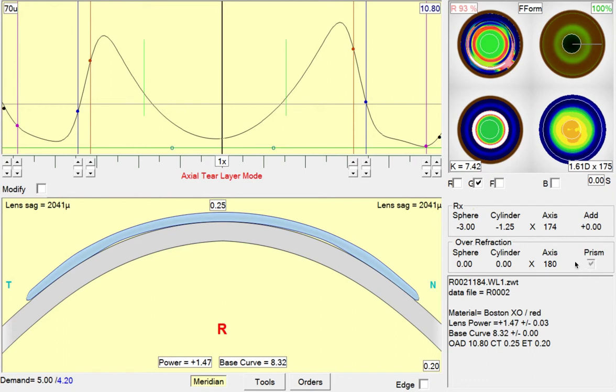In this demonstration, we're going to relieve some of the bearing at the back of the reverse curve and the horizontal meridian of the lens.